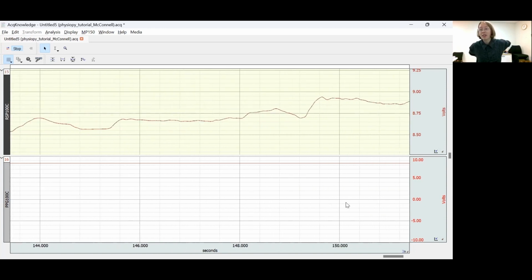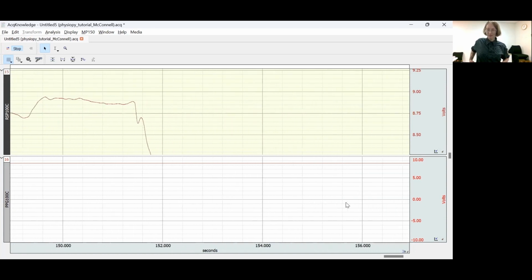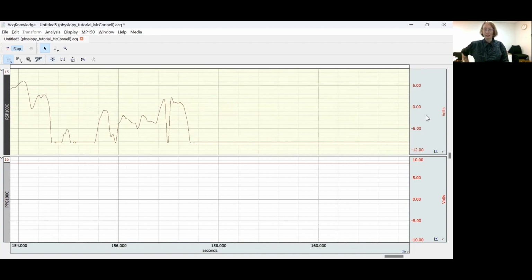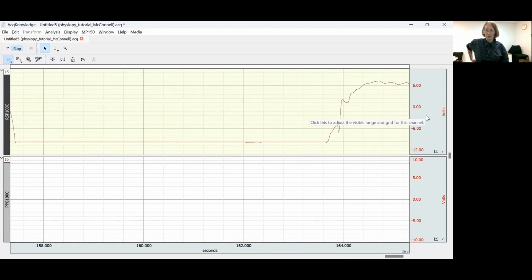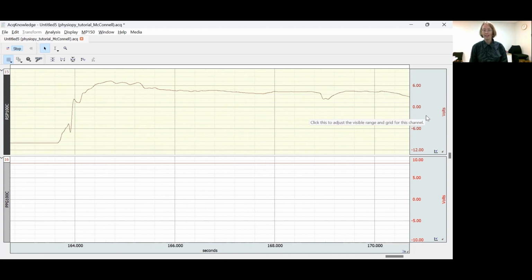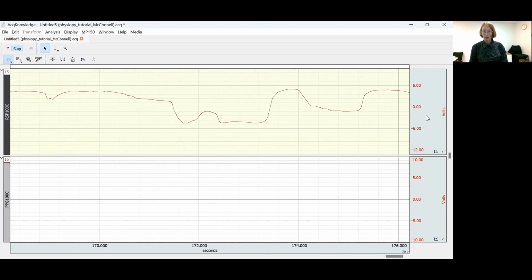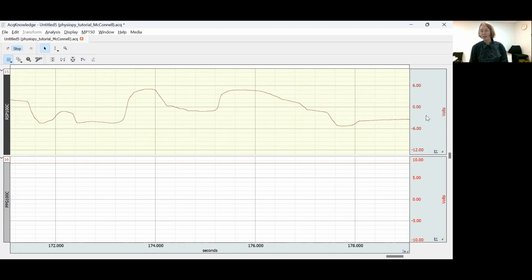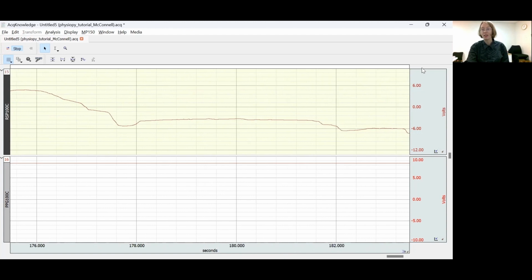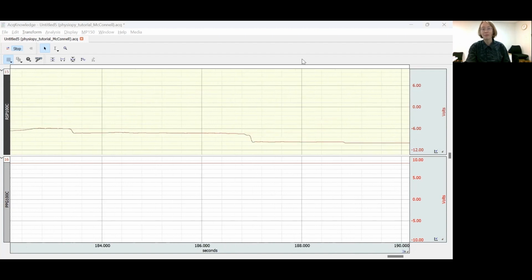Likewise, if I loosen the belt too much, our signal decreases significantly. And it still changes depending on how I'm breathing. But again, we're no longer as sensitive to all parts of the breathing cycle. So what I would suggest doing is playing with tension until you're satisfied that you're recording all of the different kinds of breathing you're interested in your scan.